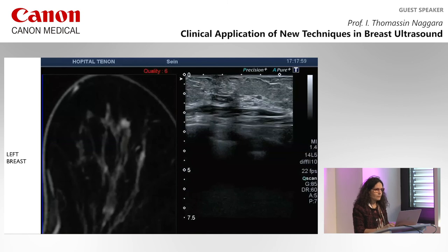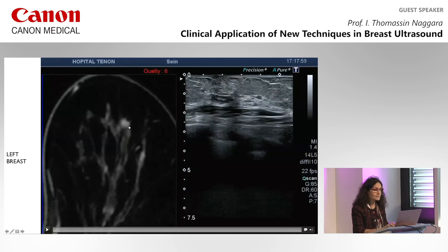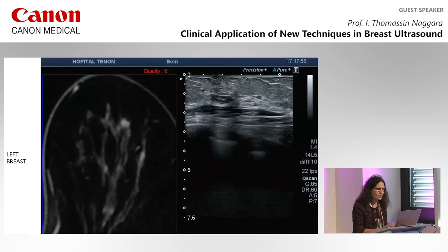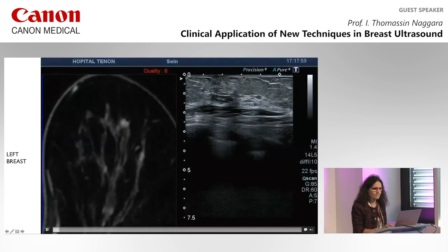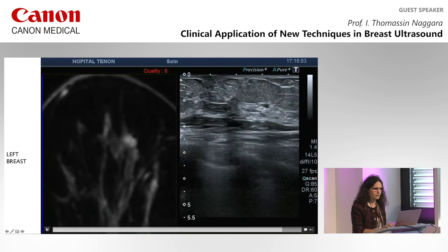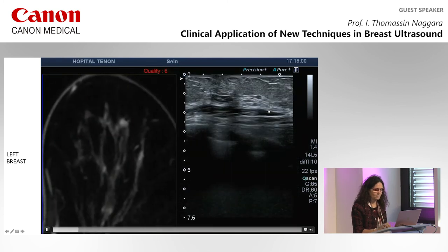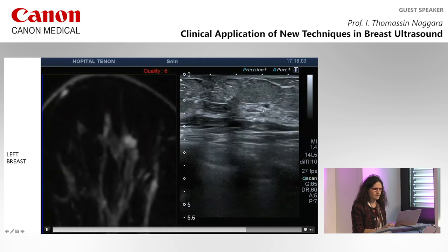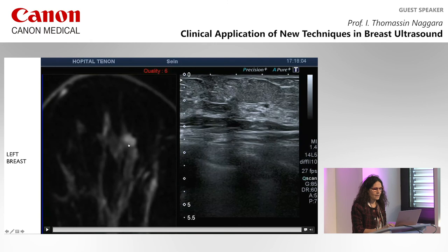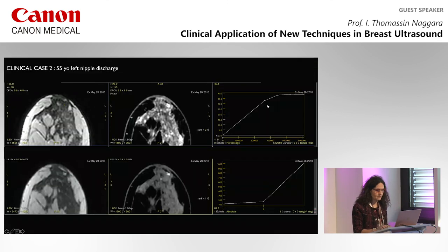On the left breast, there was also a detected mass in the context of lobular carcinoma — requiring careful attention. Using fusion, the lesion correlates between ultrasound and MRI. We confirm we are in the right place: we are on the medial part of the breast, not the anterior zone, with the fatty part corresponding to this portion of the MRI. The lesion is at the superficial part of the medial breast zone.